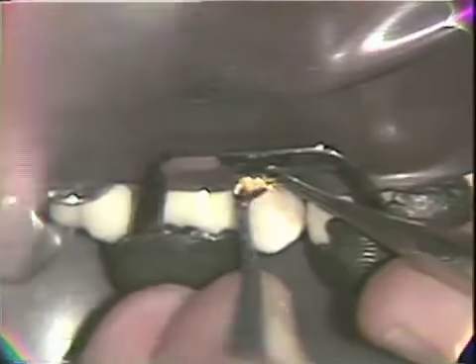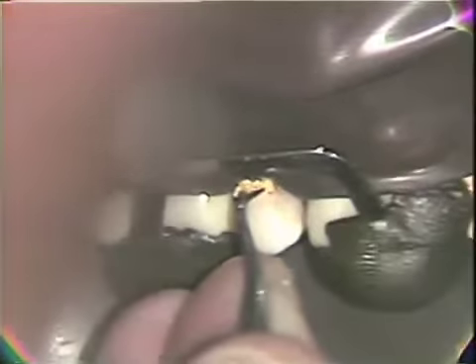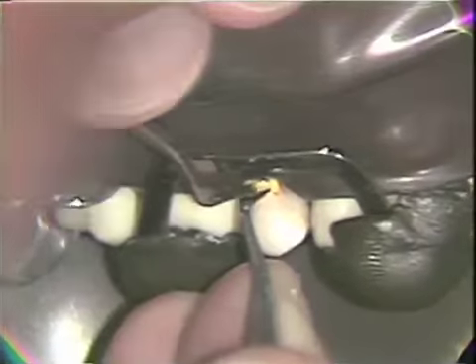Then we'll work down to the area in the occlusal aspect, again rocking from central to occlusal wall area, carrying that throughout the preparation in its entirety. And I'll move over and hold this on the distal aspect now while we condense the mesial aspect where the opposite condenser had been used as a holding instrument.